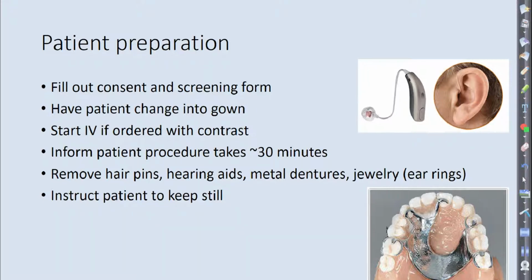If that is attached to their skull, it's contraindicated completely, because it can malfunction and they could never possibly hear again unless they get the cochlear implant fixed, which could cost a lot of money. Hearing aids, there really isn't a problem, but it could burn, right? There's a lot of electronics in there. People are a little more nonchalant about that. But patients pay a lot of money for hearing aids.